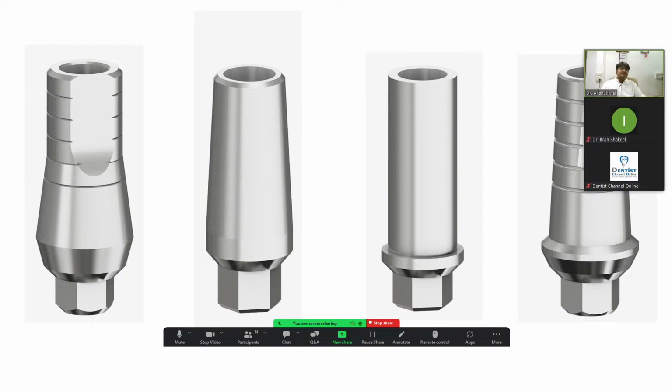So I have the same kind of question, and what I have concluded is like you have a normal crown and bridge. If I ask for PFM, they will say shoulder finish line, or zirconia shoulder finish line. For metal, they will say chamfer finish line. Same way, if you are going for metal, you have a chamfer finish line on the left side, two abutments, and if you are using PFM or zirconia, on the right side you can use the shoulder finish line. Now there is a difference between the first and second abutment. You can see the serration, and the other is a completely polished surface.